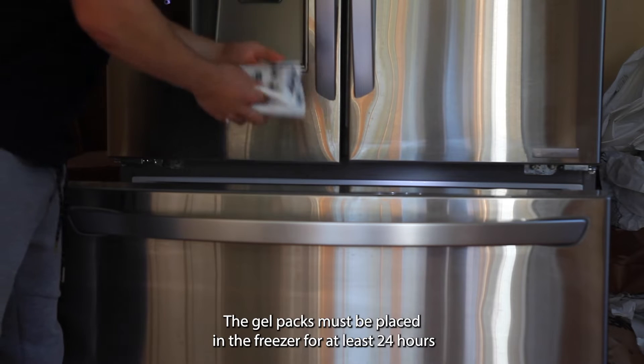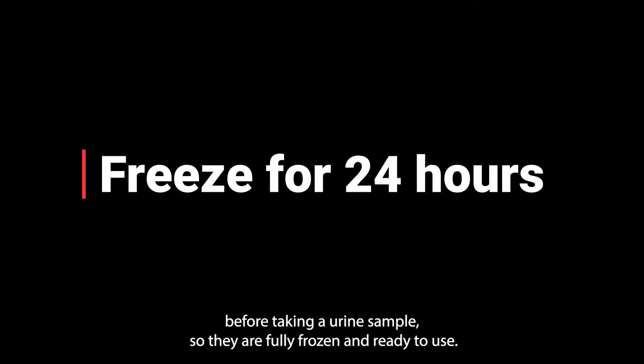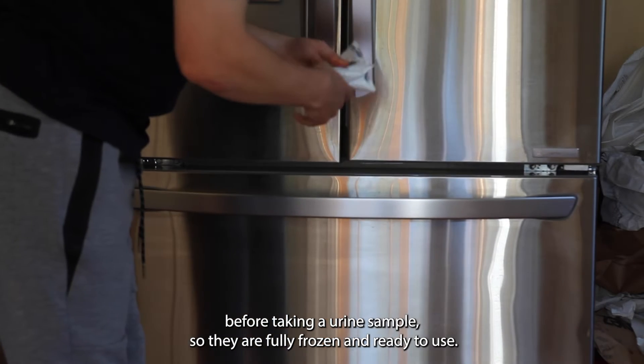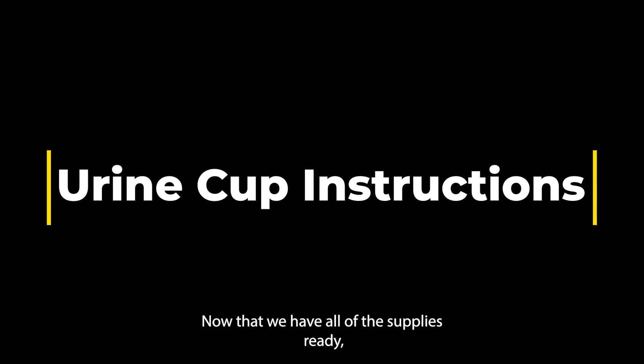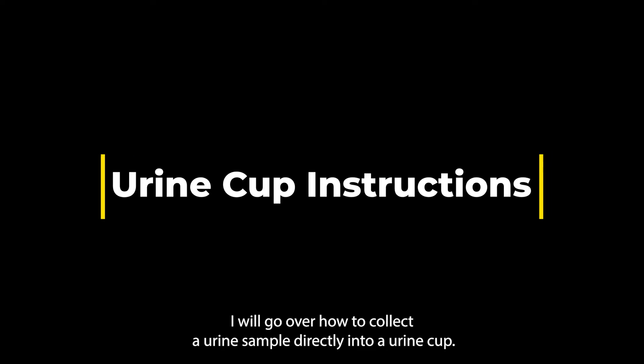The gel packs must be placed in the freezer for at least 24 hours before taking a urine sample so they are fully frozen and ready to use. Now that we have all the supplies ready, I will go over how to collect a urine sample directly into a urine cup.